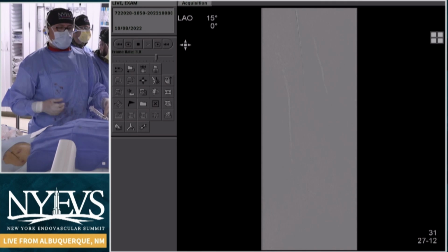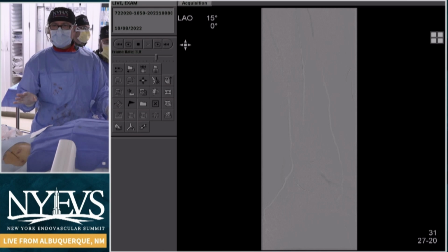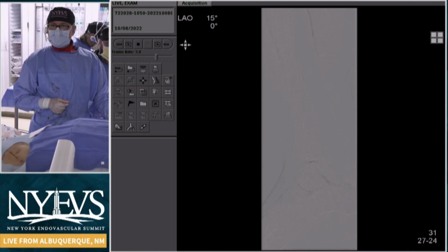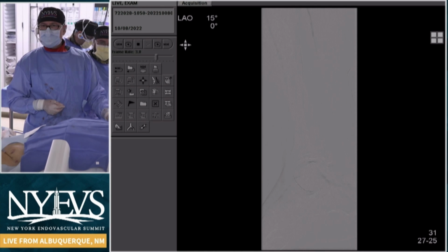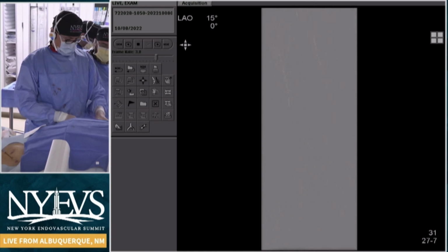And the temptation is always going to be, let me get a balloon down there and get a beautiful angiogram. And you just have to avoid cosmetic angiology. It's the worst thing. It can create a dissection. All this work that we did, you can ruin in a single inflation. So looking at this, I'm kind of thinking that we might be at the terminus. Thoughts, panel, on endpoint here? I agree. No, I agree. I agree completely.